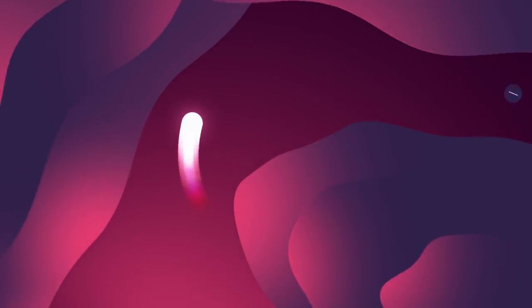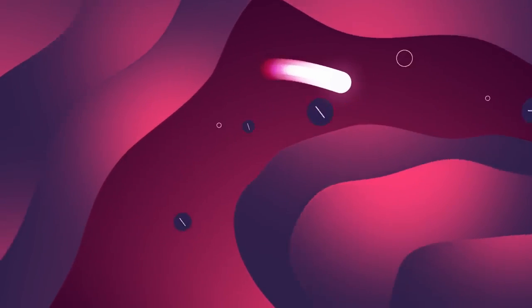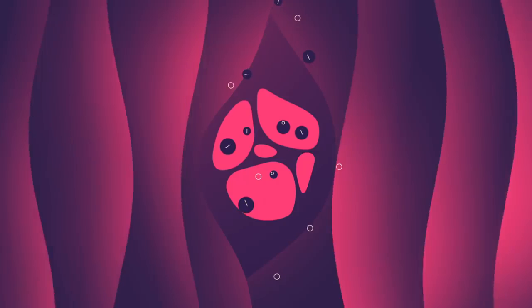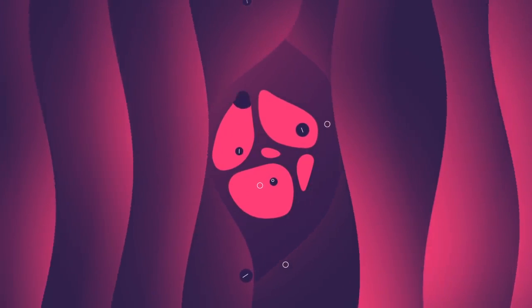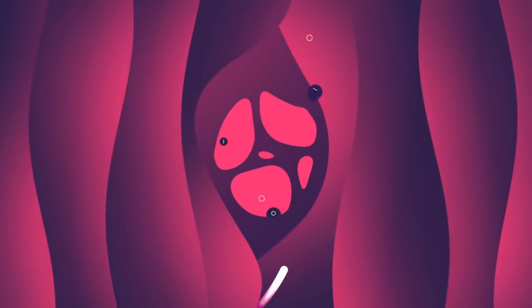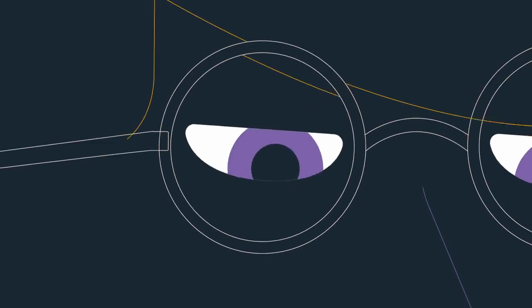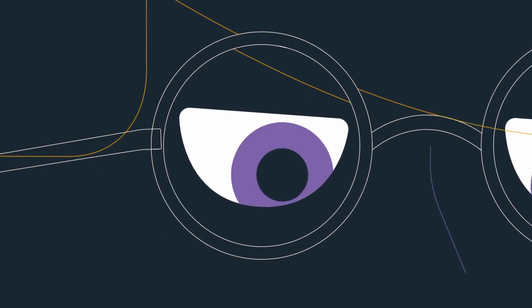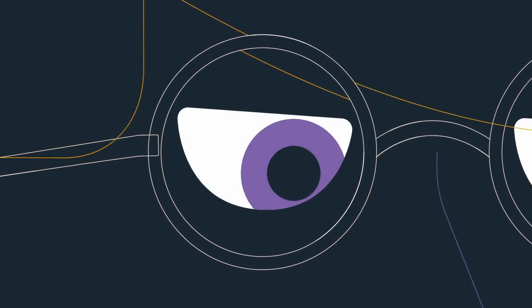By modifying the tracer to bind to specific molecules, researchers can use PET to study the complex chemistry in our brains. It's useful for studying how drugs affect the brain and detecting diseases like Alzheimer's. But this technique has the lowest time resolution of all because it takes minutes for the tracer to circulate and changes to show up. These techniques collectively help doctors and scientists connect what happens in the brain with our behavior.